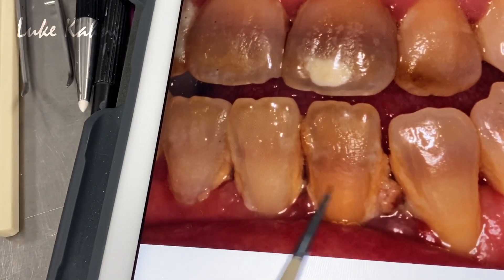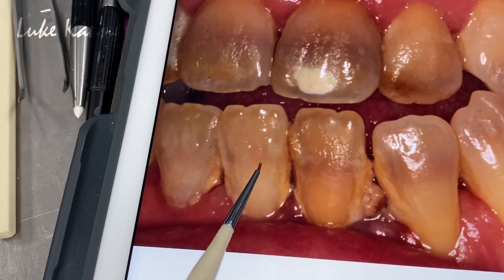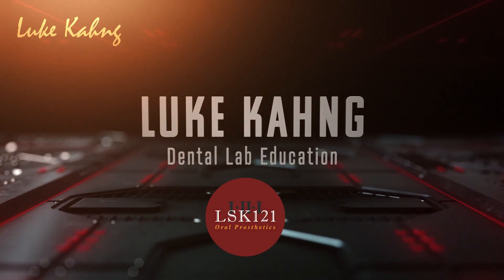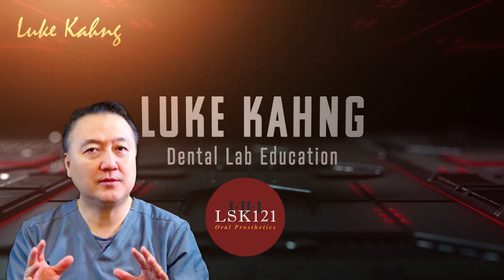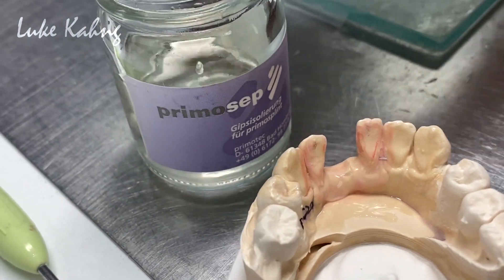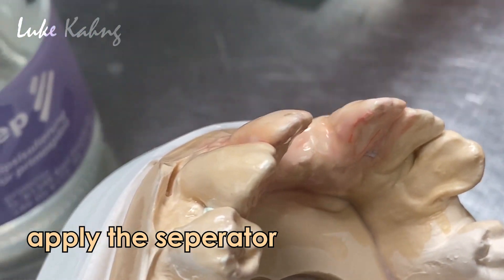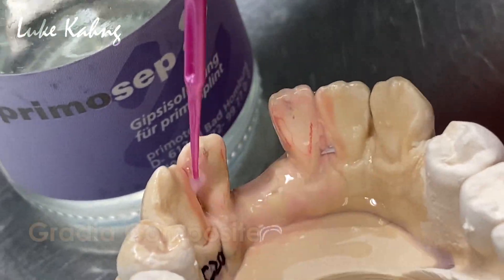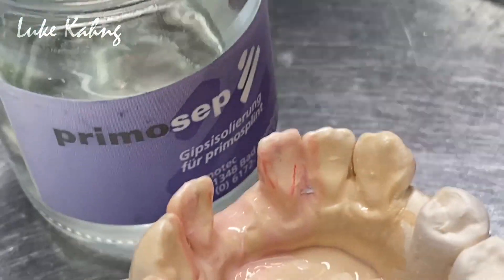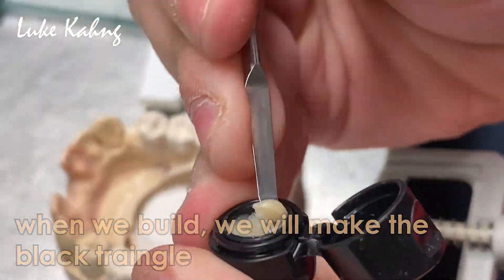So this is my final color. This is how I have to replace it. You see the little beige color, gray, tan, halo — so here. I'll show you.